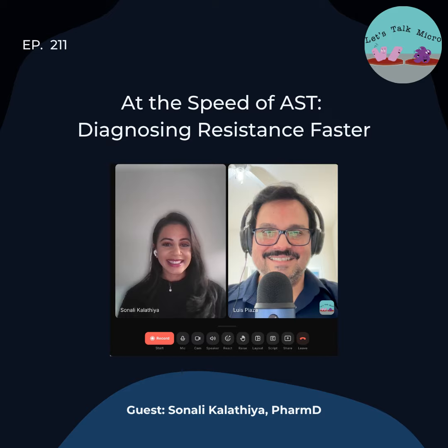I was referring to conventional AST, which can take anywhere from 24 to 48 hours from positive blood culture. So there's that lag time before you have the answer. Fast AST is hoping to close that gap a little bit and give clinicians the results sooner so they can make informed decisions for their patients.